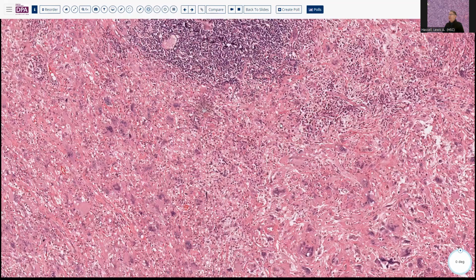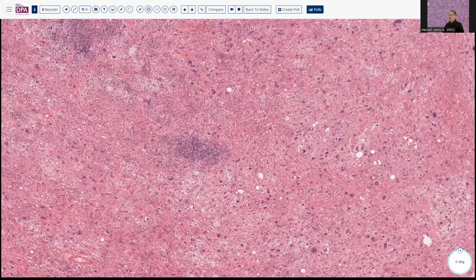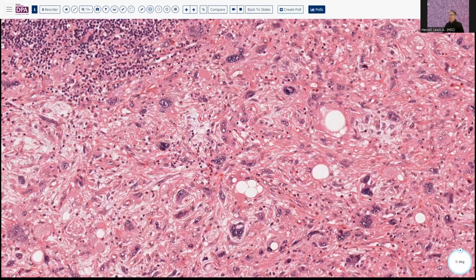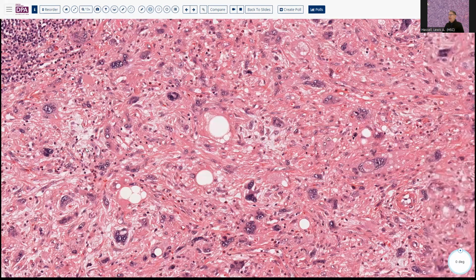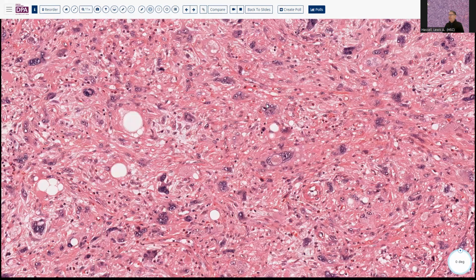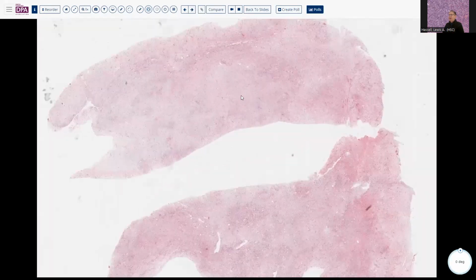That said, of course, you would want to rule out a dedifferentiated liposarcoma, because that could occasionally have entrapped fatty cells that might mimic this appearance to some degree. So considering doing MDM2 evaluation would be valuable as well. So that's a nice example of some of the spectrum that you can see with pleomorphic liposarcoma. Of course, it's not comprehensive, but gives you an example of the solid to more fatty to more cellular areas.